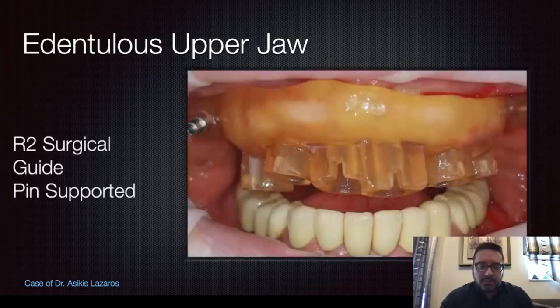Everything was delivered to the dentist: the surgical guide, the provisionals, and the Octa abutments marked in position. So on the day of the surgery, he just has to put these in sequence into the mouth. Here is the surgical guide. As I mentioned before, we have used pins. We have used a large surface of the upper jaw to have the surgical guide supported.